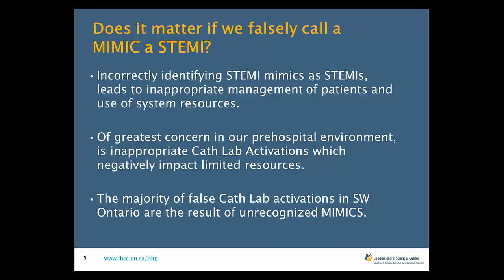And again, this may have nothing to do with ST elevation or coronary artery disease. The ST elevation may be caused by something totally different, and that patient may be served better at the closest hospital, the closest ED. Matt, I think hyperkalemia or maybe an aneurysm, admittedly both things we're not going to talk about today, might be good examples where bypassing the local center is not going to be in that patient's best interest. There's definitely one cause, which we're not going to get into here, which is neurological causes of ST elevation. Catastrophic neurological events or bleeds into the brain can cause ST elevation on the ECG. And again, these patients would be best served at the closest emergency department for stabilization.